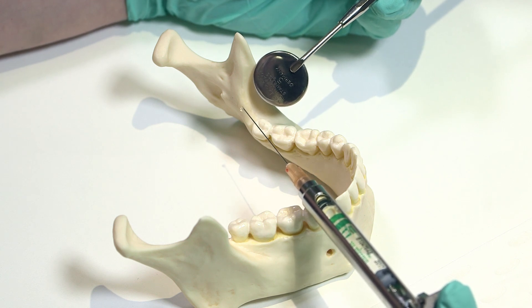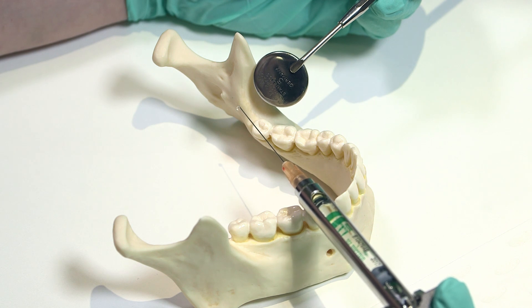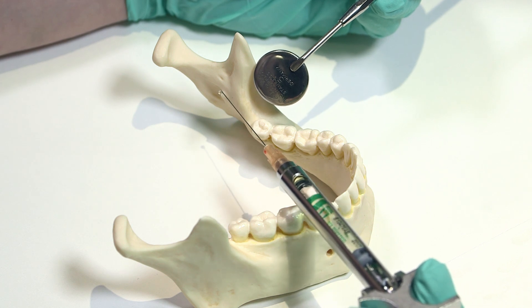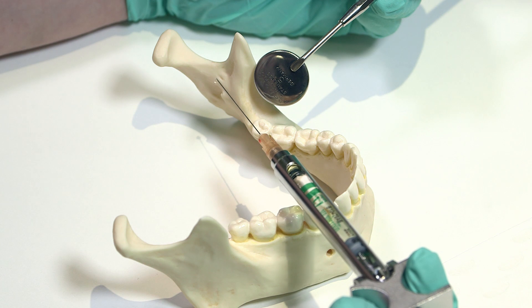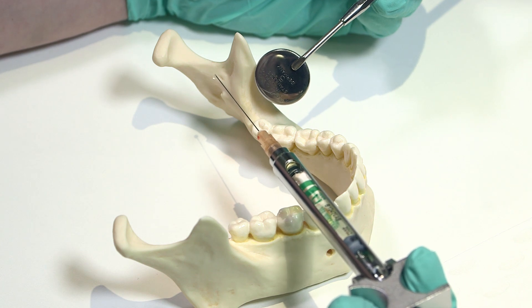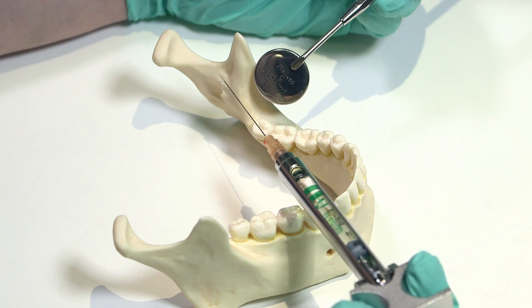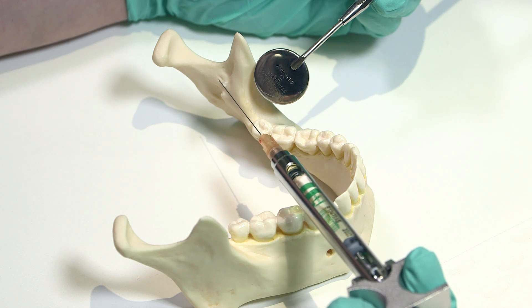It's usually placed around 10mm above the occlusal plane. We insert the needle approximately 20–25mm, which is about two-thirds to three-quarters of a long needle. There should be no resistance until you gently contact the bone.